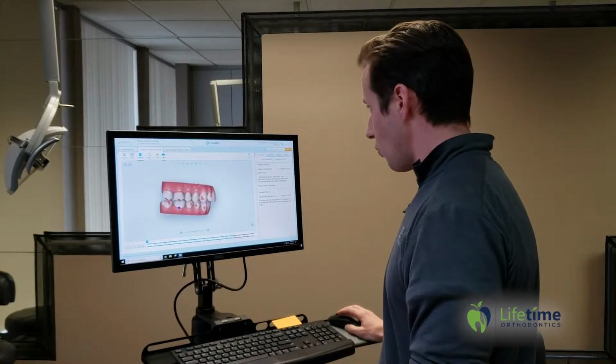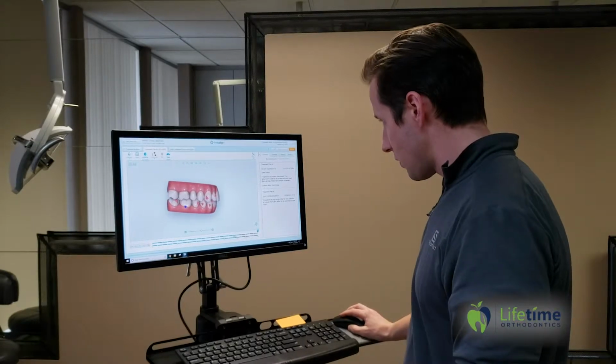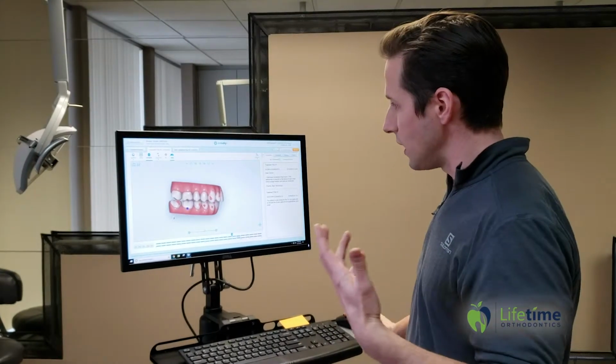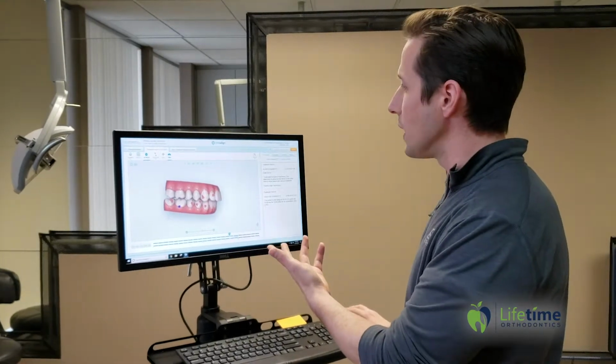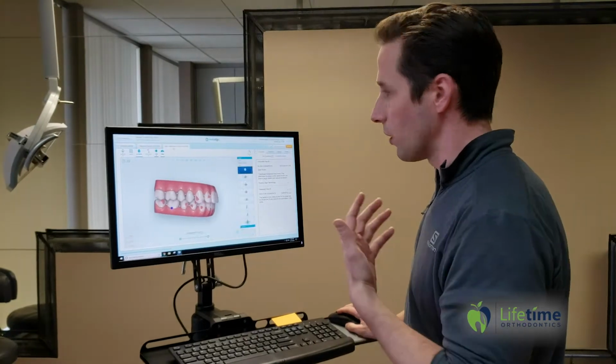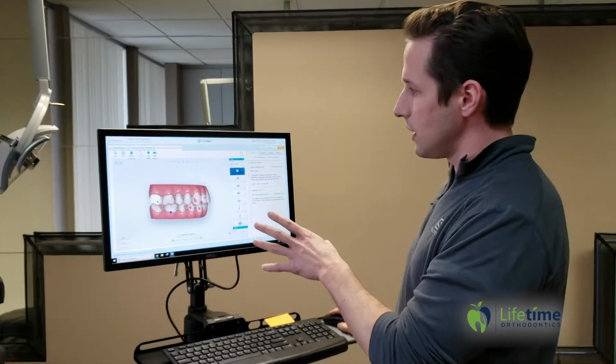Okay, and so however, I don't like the way they did it, right? This is what they've done. They've kind of set it in 18 trays, and I just know, because I know how to move teeth, I know this is not the reality. So I need to move this in a way that suits my bite, or what I know will work. So first of all, my goal in this first set is to get these teeth out of contact.